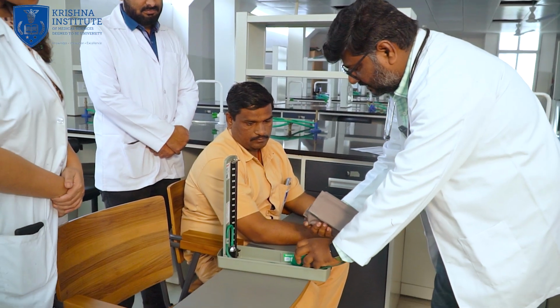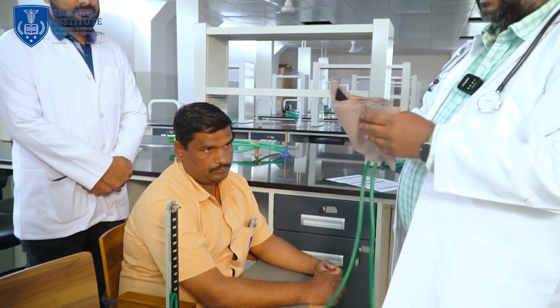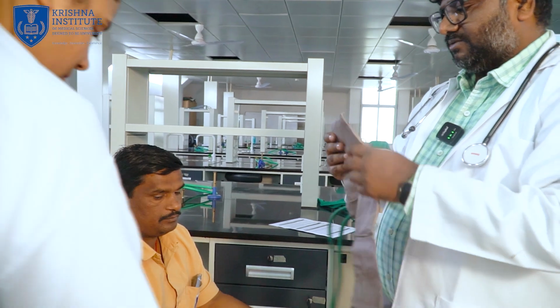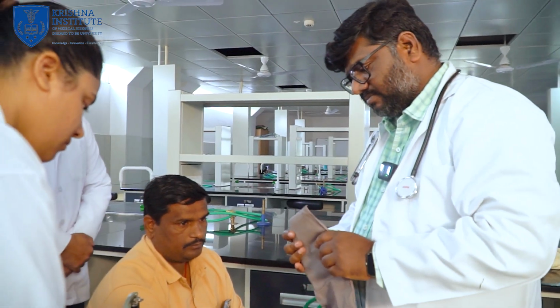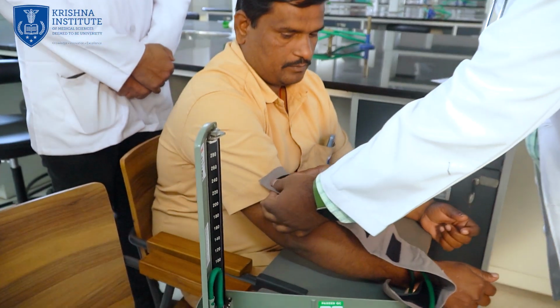It should be at the level of the heart. Check the cuff size, whether it is appropriate or not. Ensure that it is completely deflated, and we have to confirm.